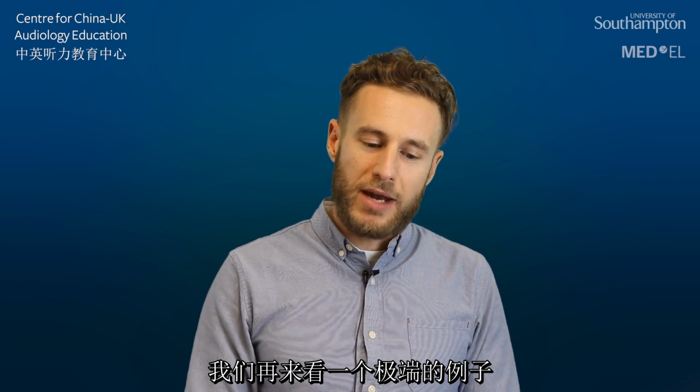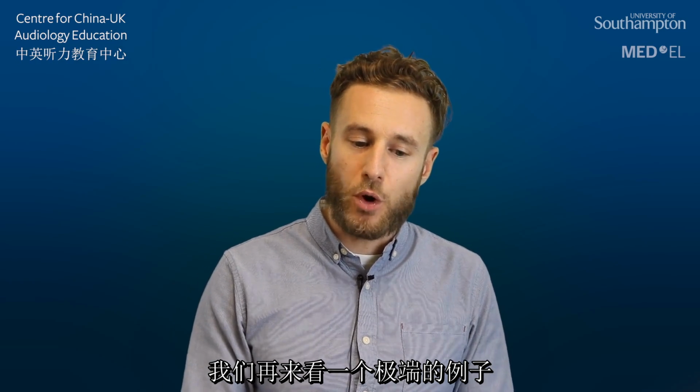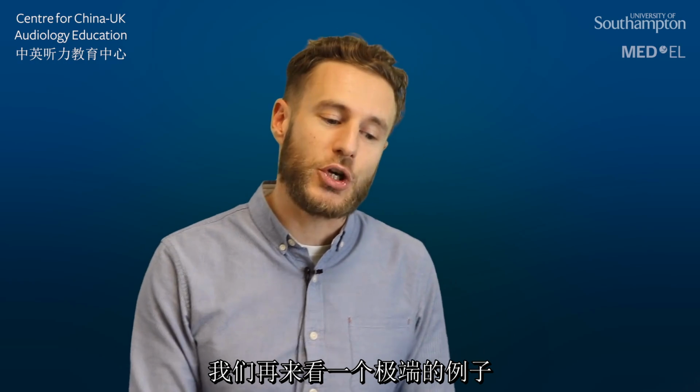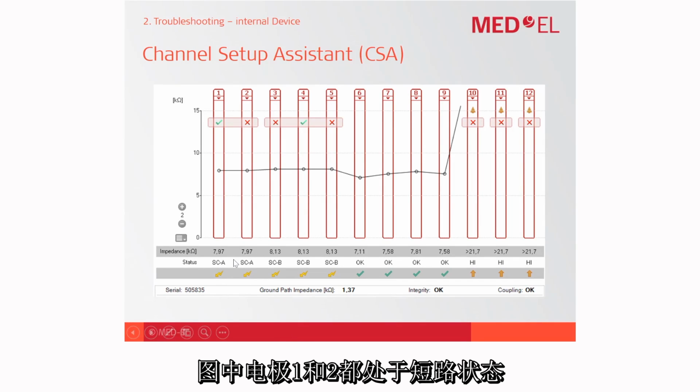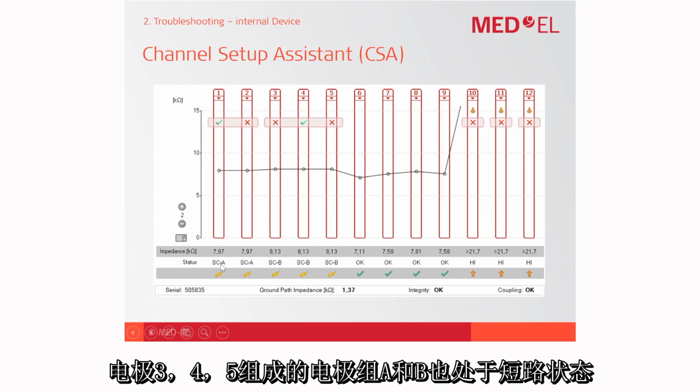Okay, so when we look at the more dramatic situation as shown in here, we see that in these examples multiple short circuits are present between electrode 1 and 2, indicated by short circuit A, and a second group indicated by short circuit B between electrode 3, 4 and 5.